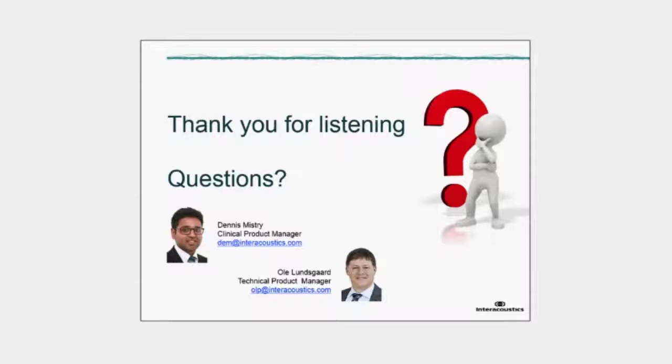Yes, thank you, Hella. So a common question that we've been asked from the previous webinar is, can the skull simulator be used with the TBS-10? And the answer to this is no. So for commercial segregation of the products, we've intended for this product, the skull simulator, to only be used with the Affinity.